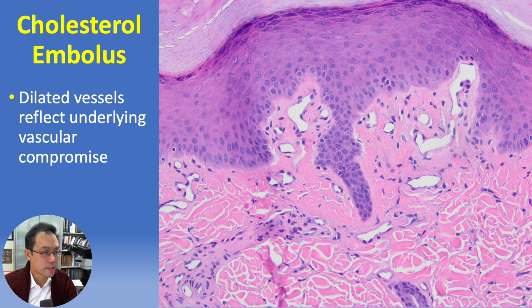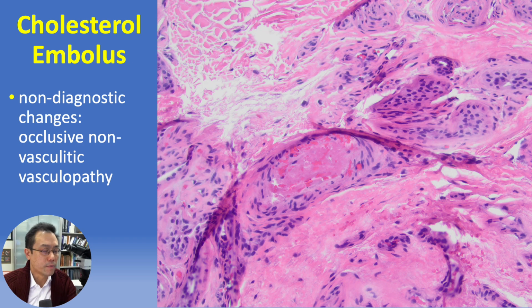Short of subepidermal clefting with confluent epidermal necrosis, more subtle ischemic necrosis may be reflected by dilatation of distal superficial dermal vessels. And unfortunately, in seemingly too many cases, biopsies are simply non-diagnostic. Even with deeper sections, the profile is simply that of a dermal vascular thrombosis, and cholesterol clefts cannot be identified despite best efforts.